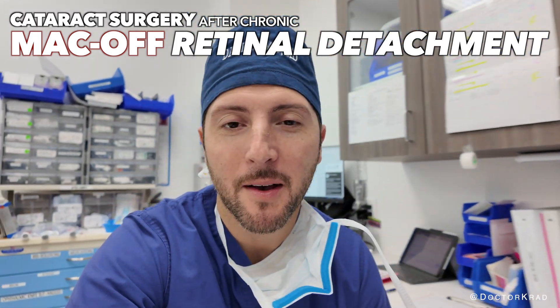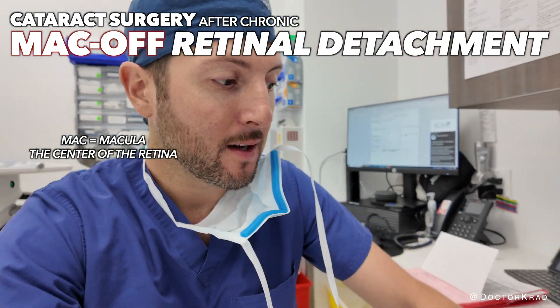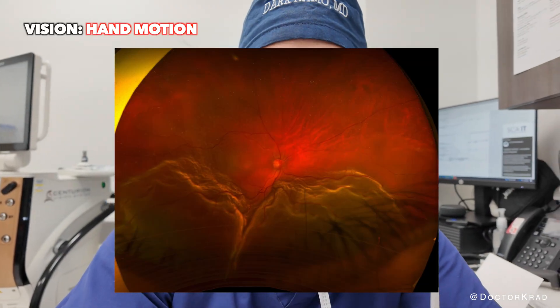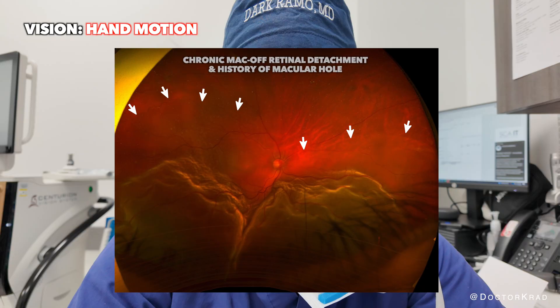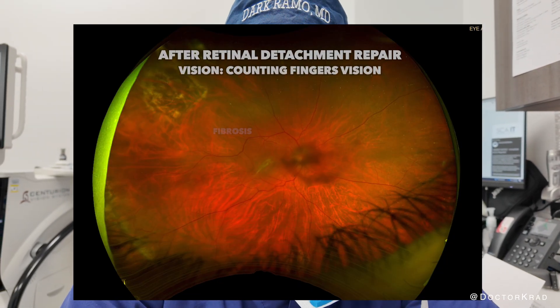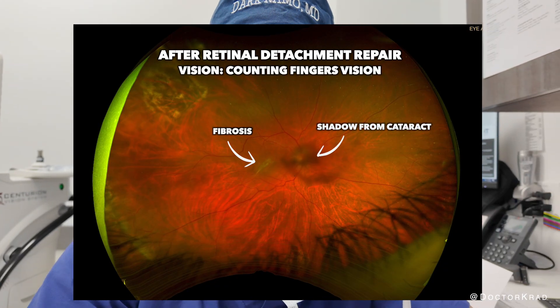Hi everyone. Today I have a patient case where the patient suffered a MAC-OFF retinal detachment and she lost her vision completely, and then had the retinal detachment repaired. After which she developed a very big cataract, and today we're going to remove her cataract and put in a lens implant.